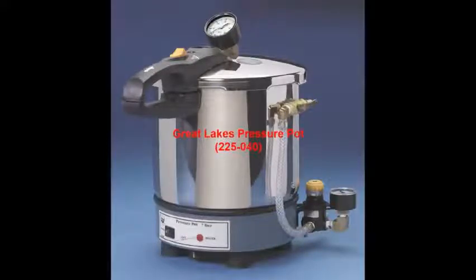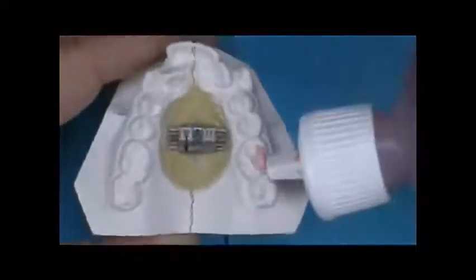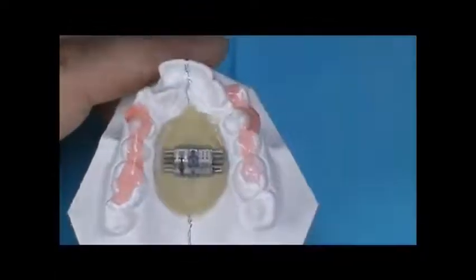Models are not submerged. After 15 minutes of cure time, the model is removed from the pressure pot. Liquid separator is reapplied to the dentition only. No separator should contact acrylic or screw area.